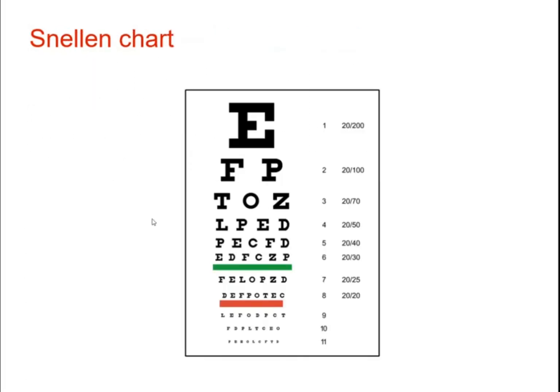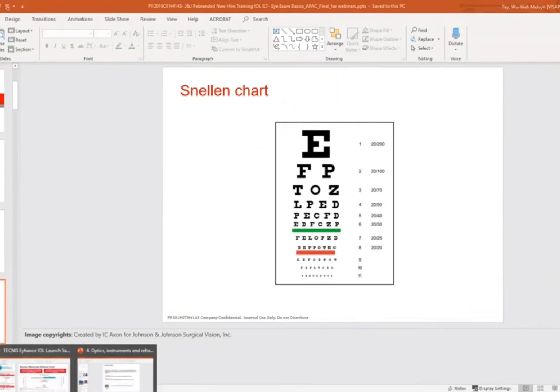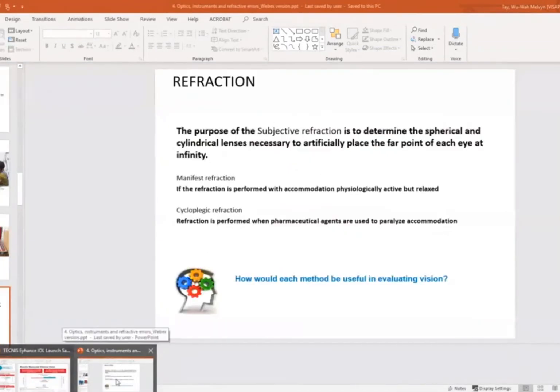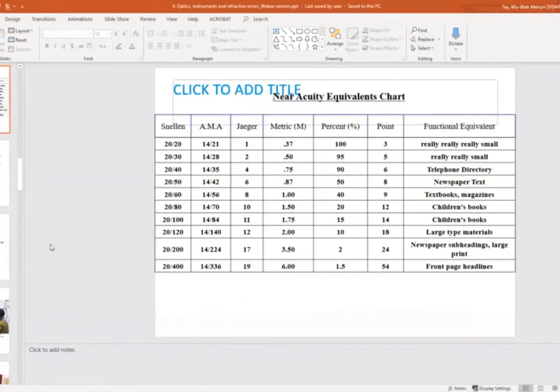And there's another way of measuring visual acuity. Sorry, I'll show you how it's represented.